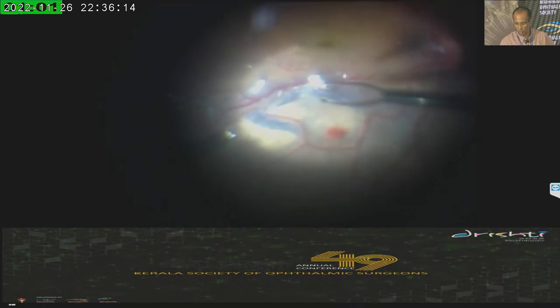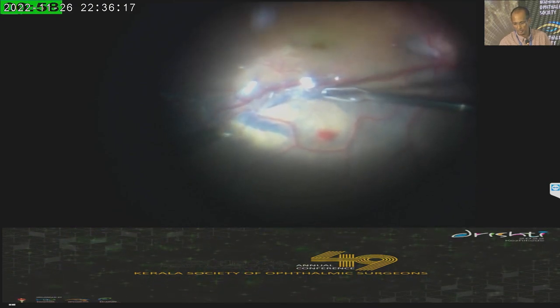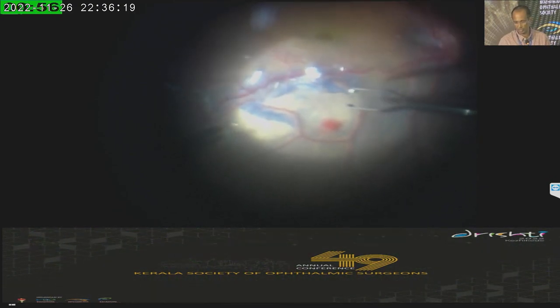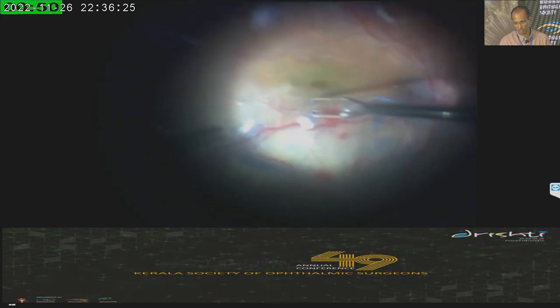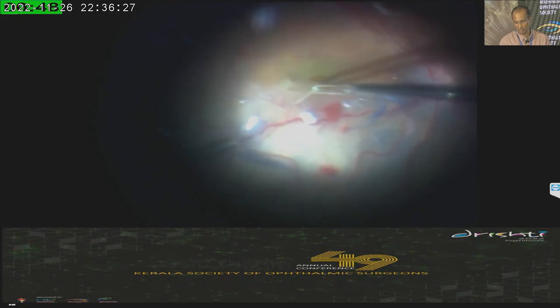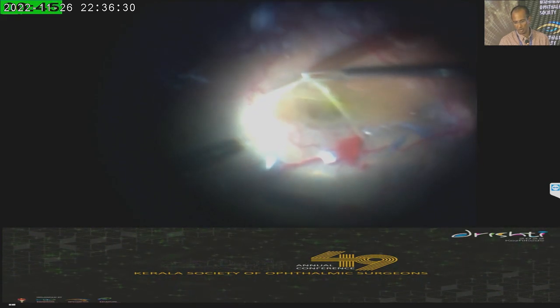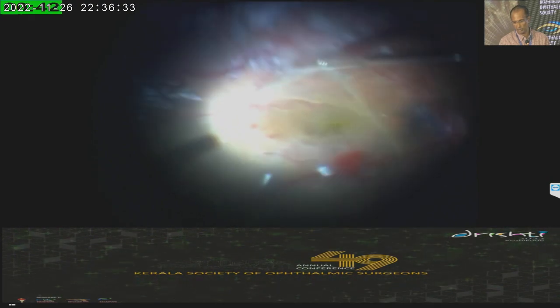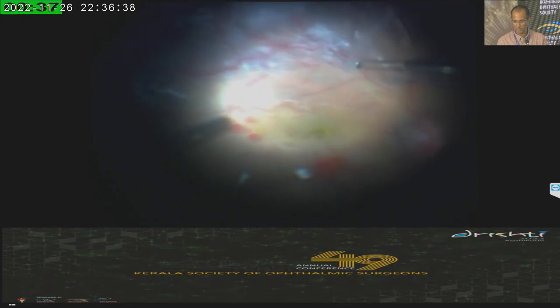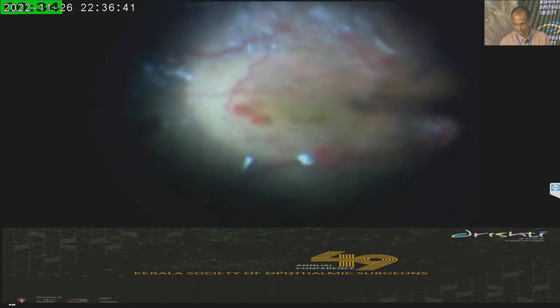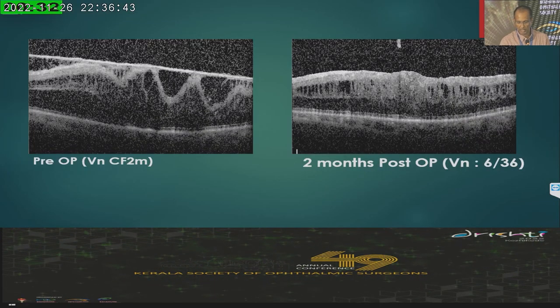In another case, again the same technique — starting the ILM peel from an area much beyond the ERM, then coming to the edge and grasping the ERM. In this case, the ILM fragments, so I'm not certain I got everything, but it is a very thick ERM and it is coming out as a whole. That is the ERM coming off, followed by the fluid-air exchange. The preoperative and postoperative OCT show improvement.